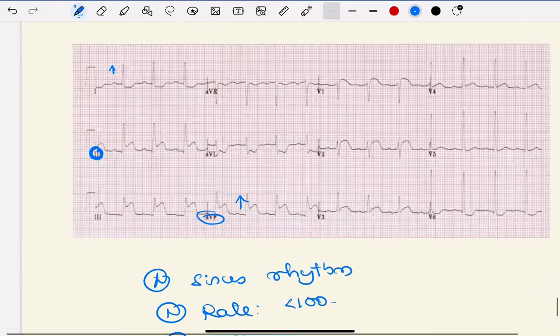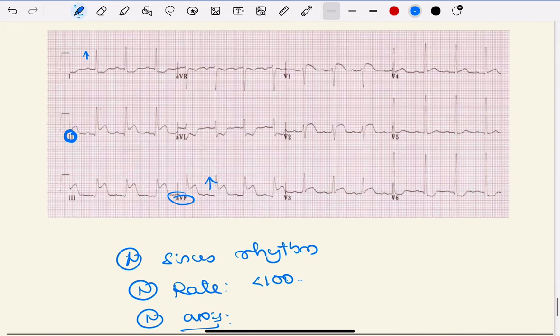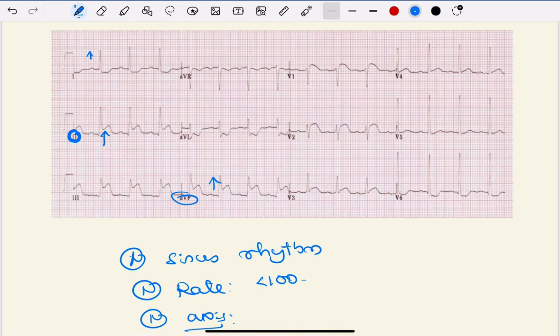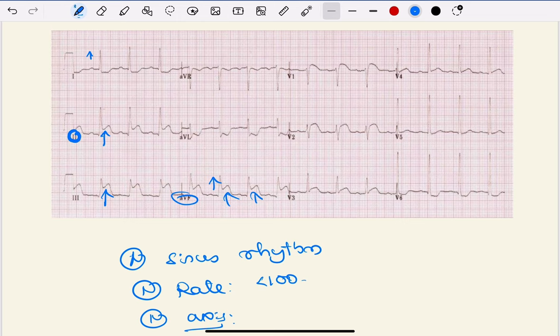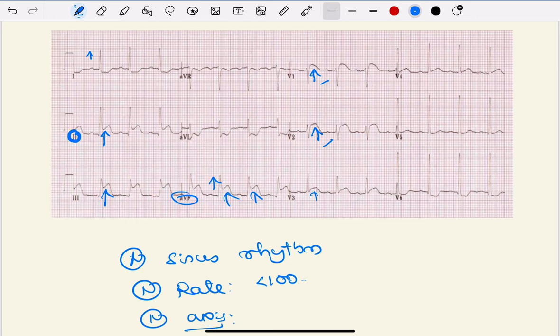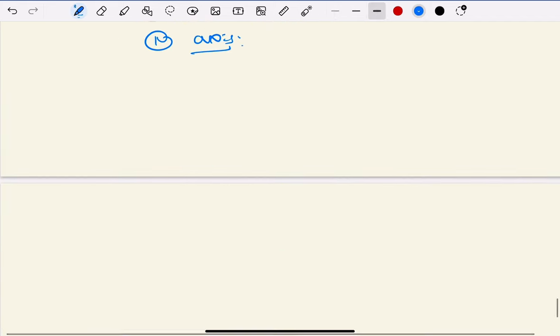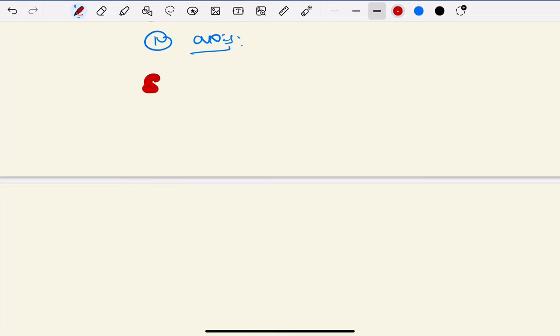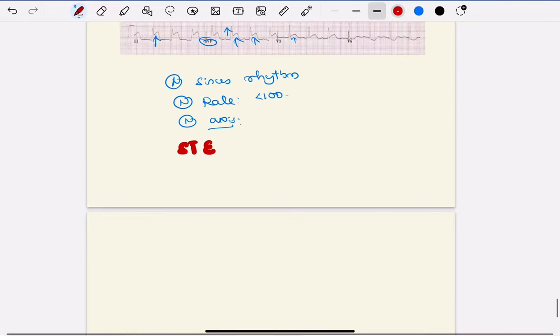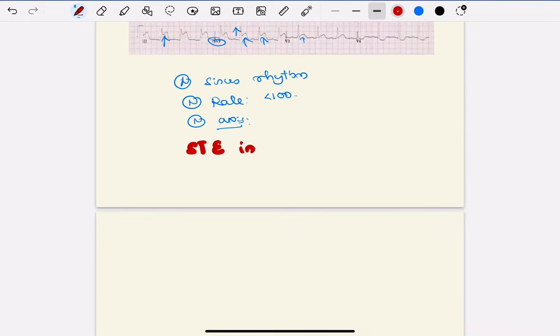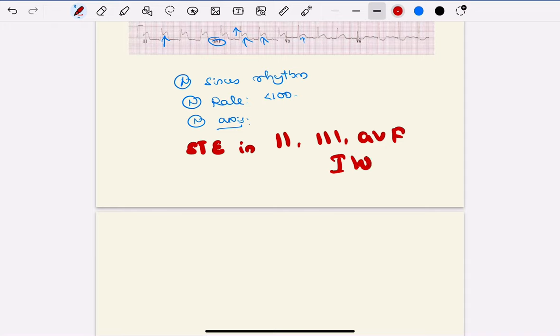If you look carefully, what is striking here is there is ST elevation, which is an emergency. Look at leads II, III, and aVF - there is ST elevation. aVL shows reciprocal ST depression. There is ST elevation in II, III, aVF which suggests inferior wall MI, and there is ST elevation in V1 and V2 also.